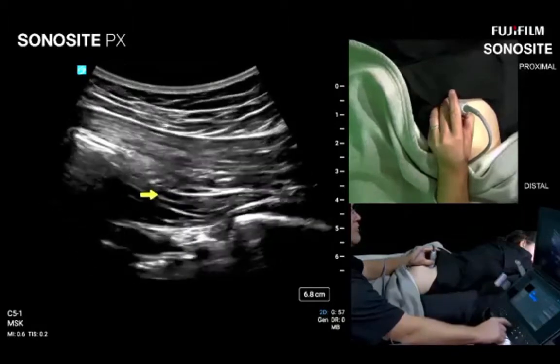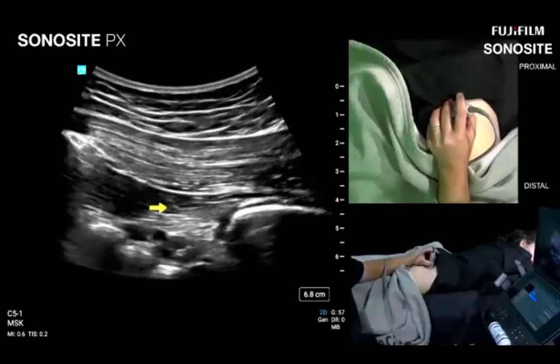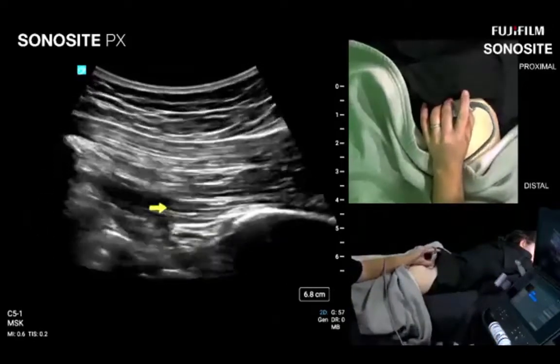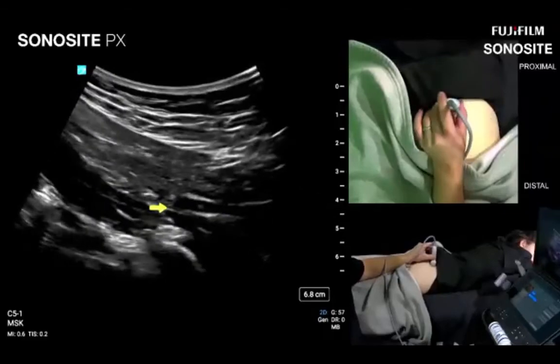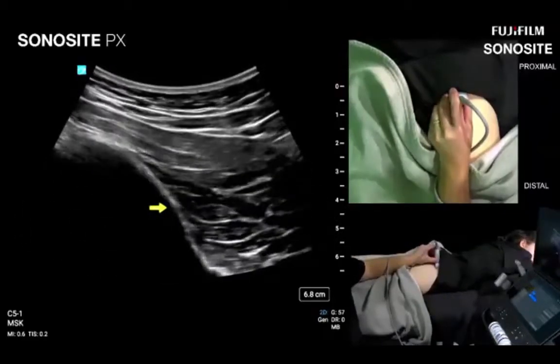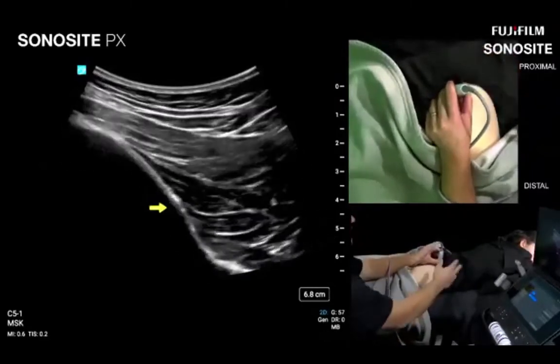Bill points out one of the most common mistakes — not obliquing the transducer to go along the diagonal course of the piriformis. When first learning this, it is useful to elongate the glute max since the piriformis runs parallel to it. Because the glute max is such an oblique structure, you need to pivot the transducer to set up for the long axis of the piriformis.